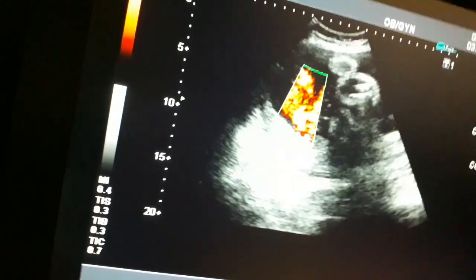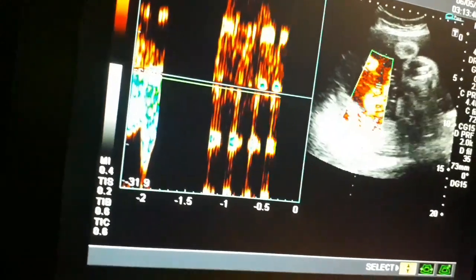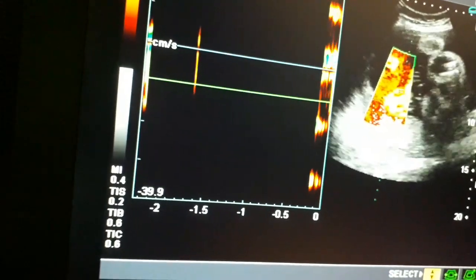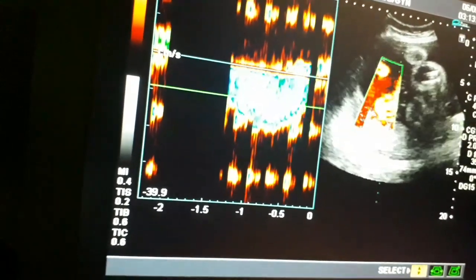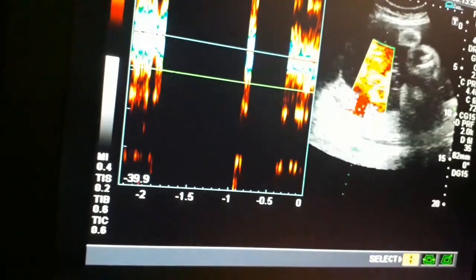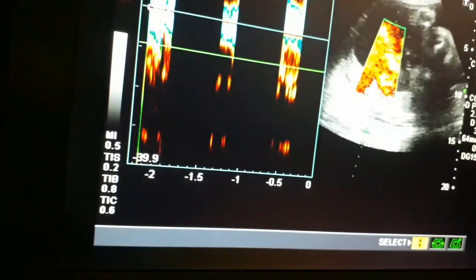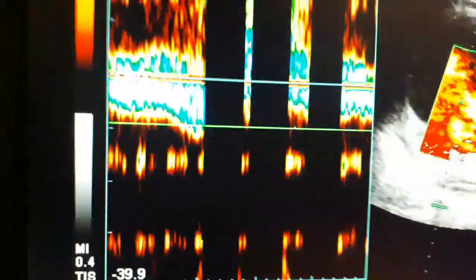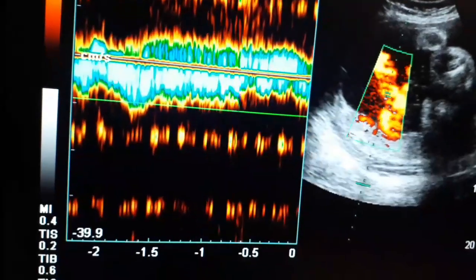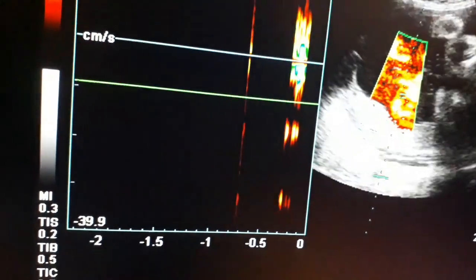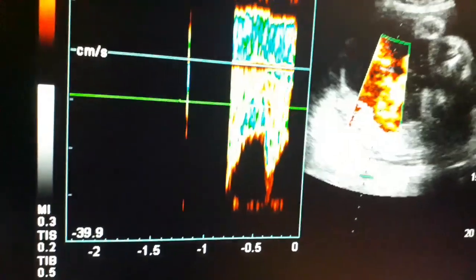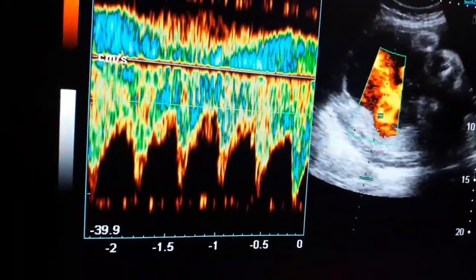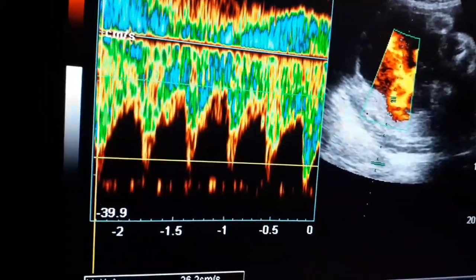Now I am putting the power Doppler into the umbilical vessel to calculate the S/D ratio. As I explained in previous videos, as pregnancy advances the S/D ratio decreases — from about 4 at 20 weeks down to 1.8 at term. This decrease indicates increased diastolic flow as pregnancy advances, which is very important for fetal blood supply.